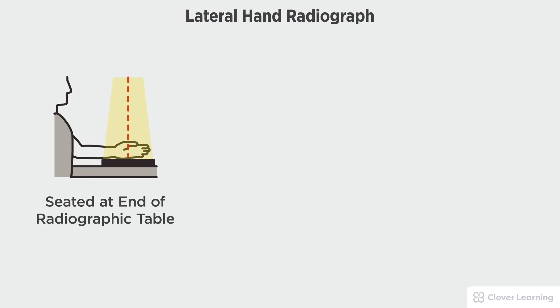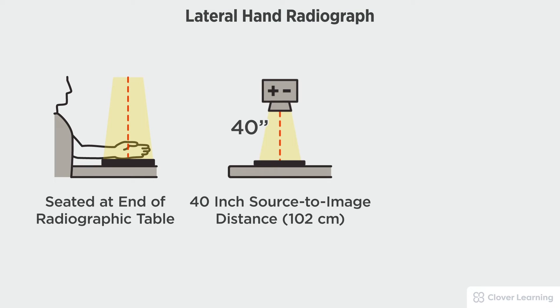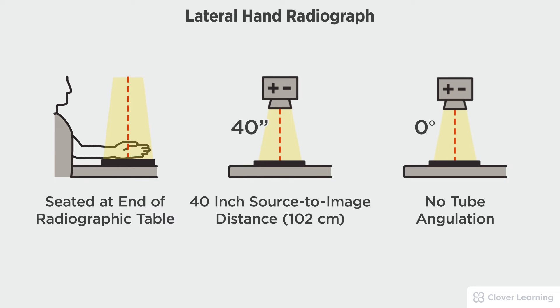In this view we will be demonstrating the lateral hand. The lateral hand should be performed with the patient seated at the end of the radiographic table with the image receptor placed tabletop with a 40 inch source to image distance and no tube angulation.